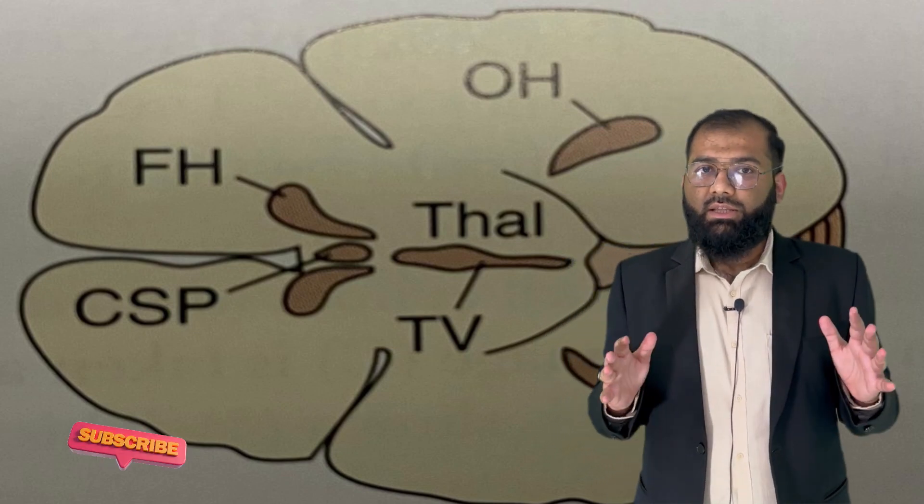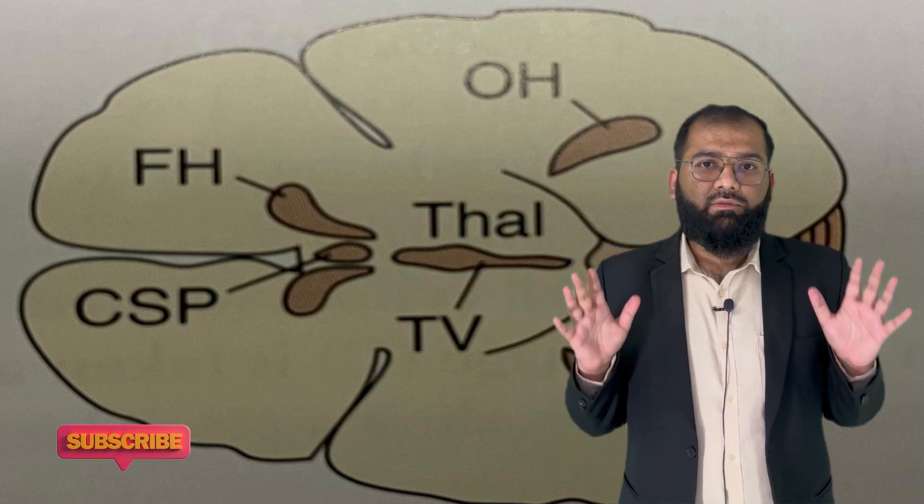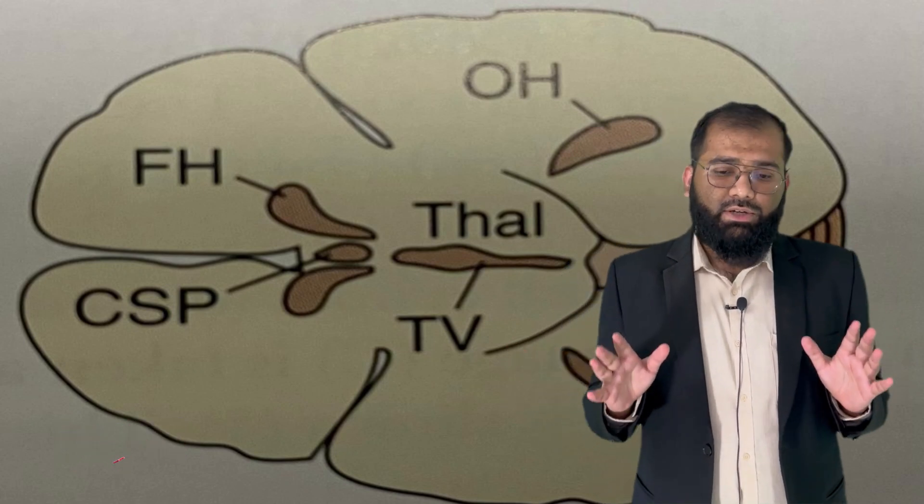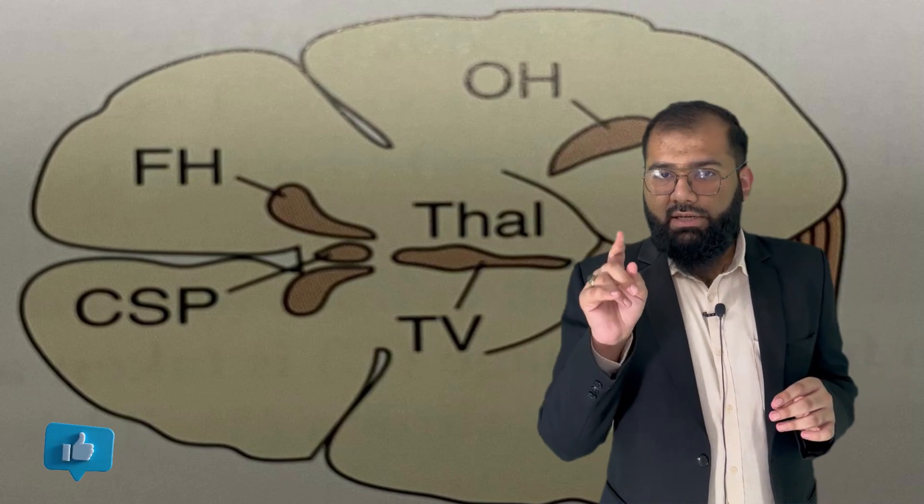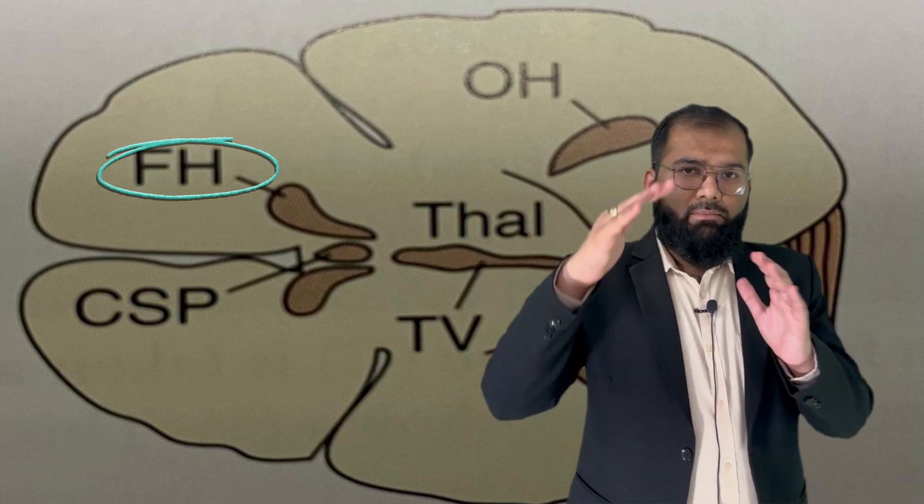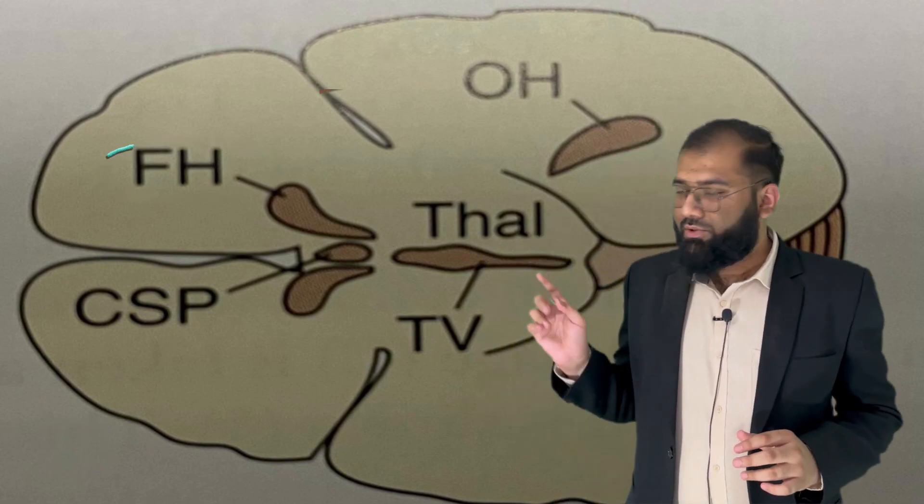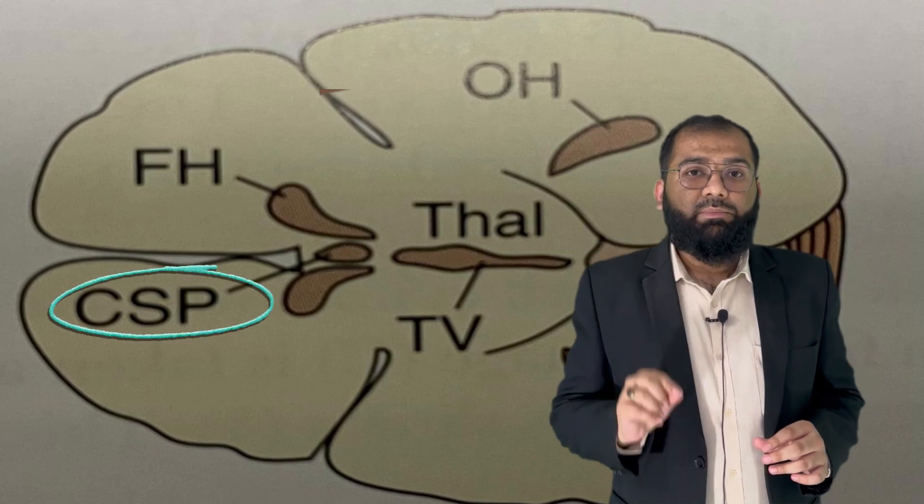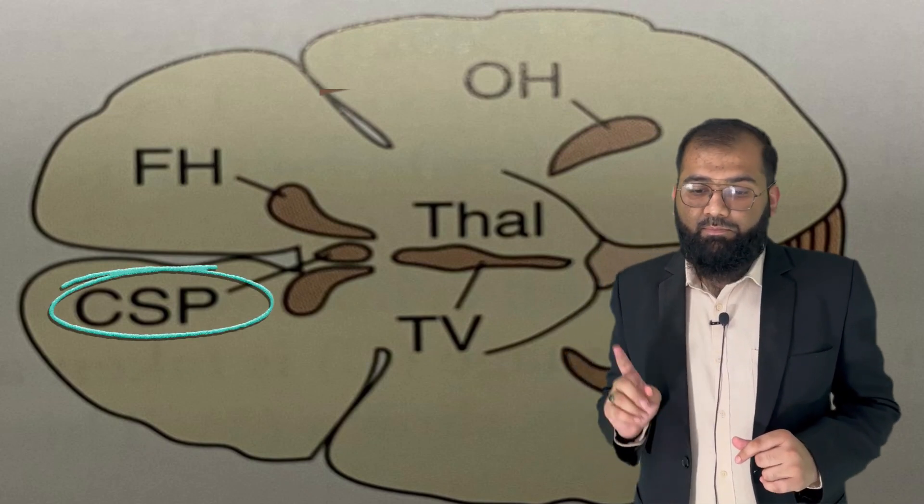In the image you can see the transverse section of the skull. It's an illustrated image where you can see two FHs. FH stands for frontal horn, and between two frontal horns you are able to see CSP, that is cavum septum pellucidum.